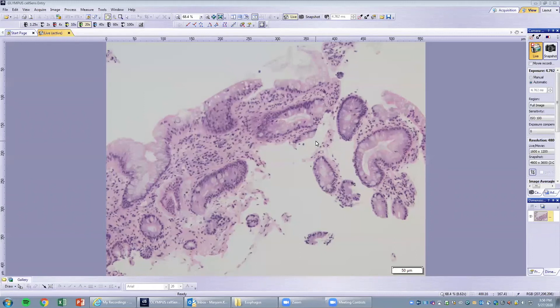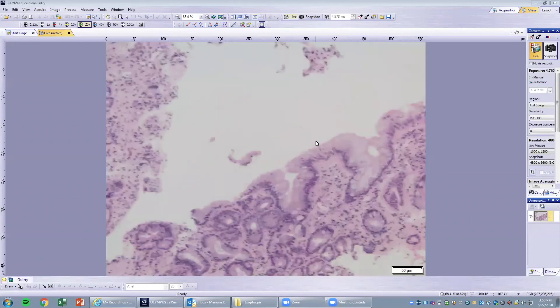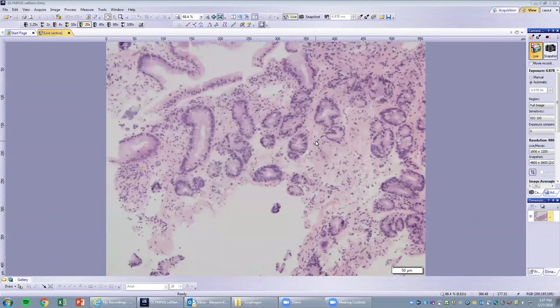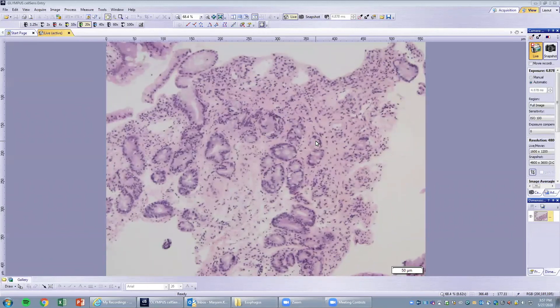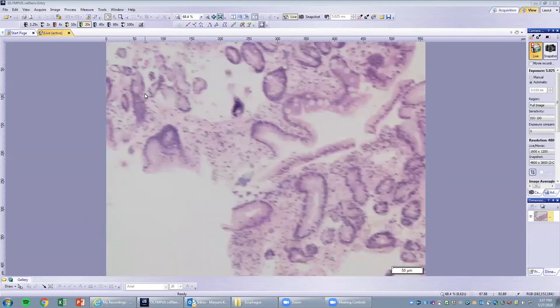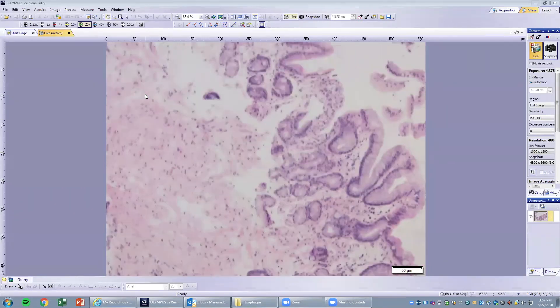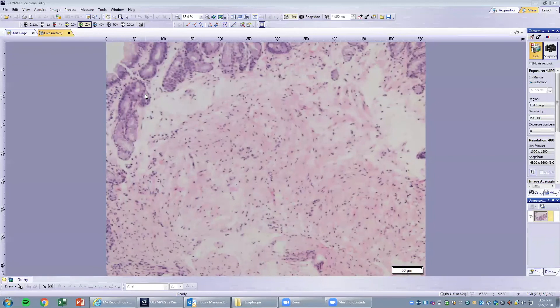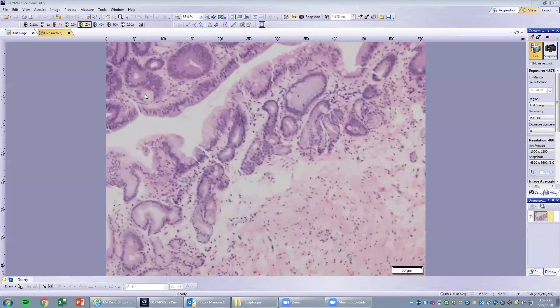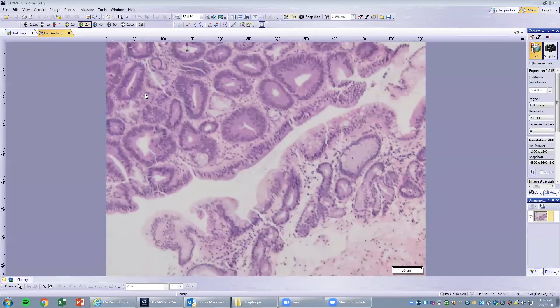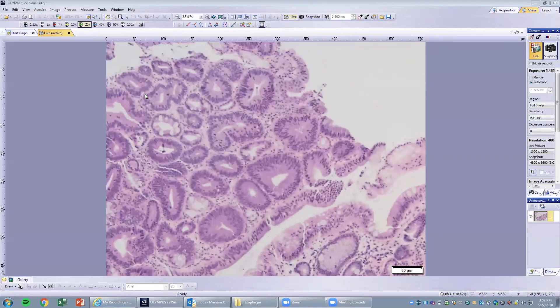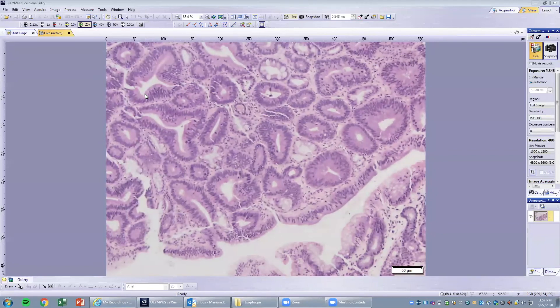Moving around in this biopsy, you can see some areas with goblet cells and some areas without goblet cells. This is Barrett's esophagus. Whenever we get a Barrett's esophagus biopsy, we always need to evaluate for the presence or absence of dysplasia. This patient has extensive low-grade dysplasia.